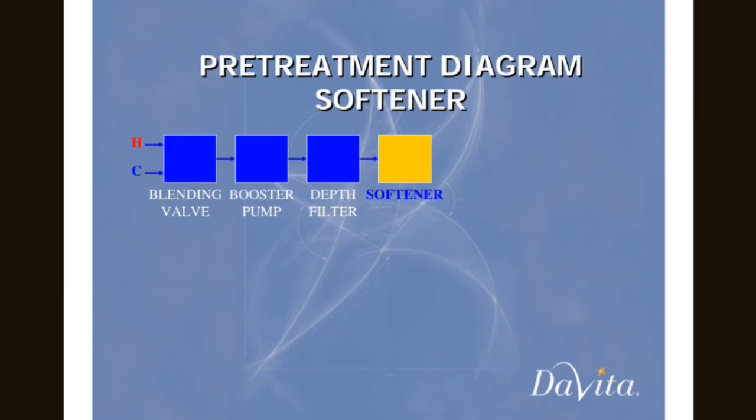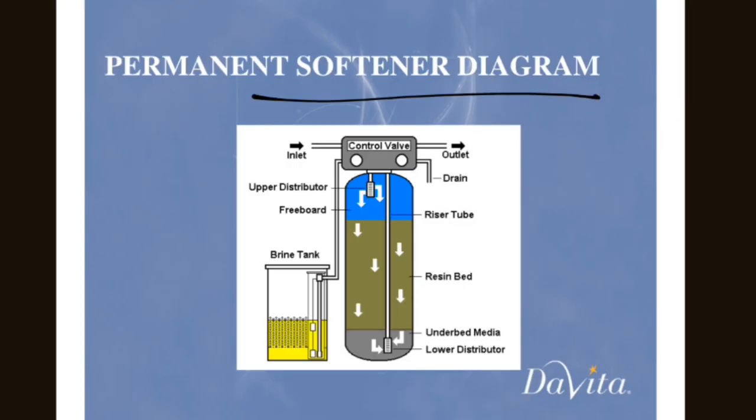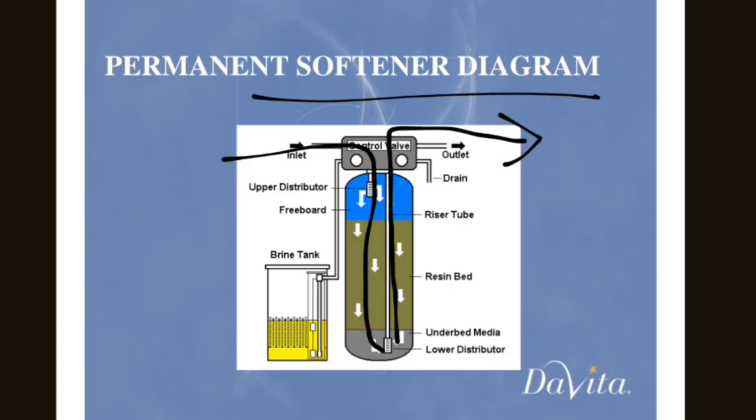So our second filter is the water softener. Water softeners are filters which decrease the hardness of water by removing calcium and magnesium mainly, and other solutes also. So water passes through this, and filtered water passes to our third filter.